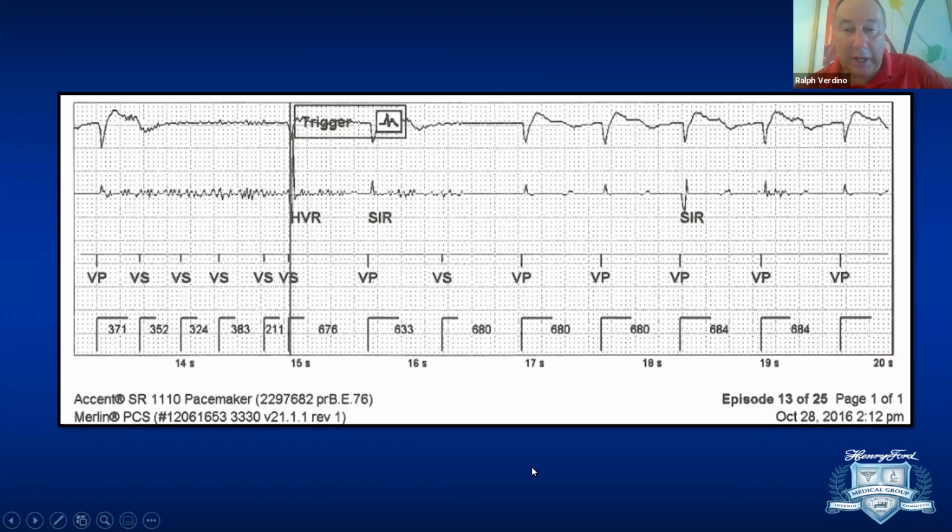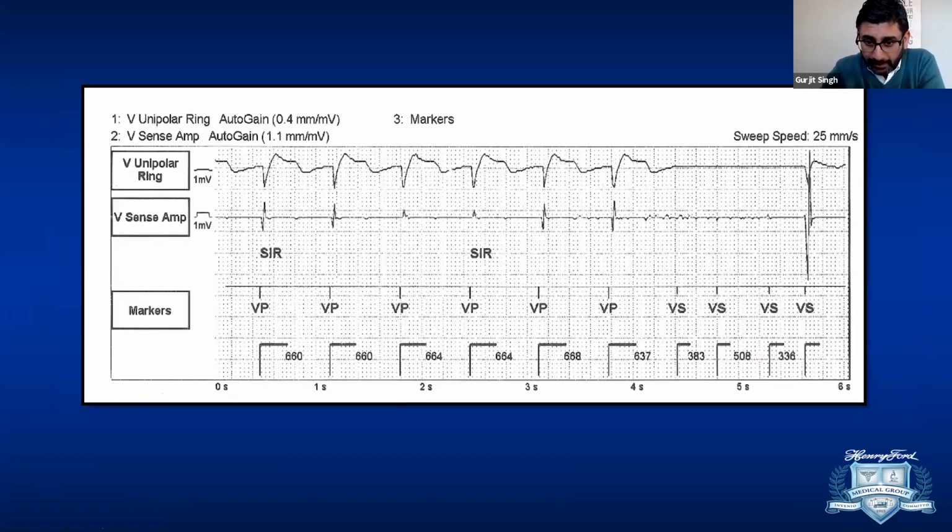We have noise, oversensing. Okay, very good. So yeah, that's correct. It's noise which was being oversensed as a non-physiological signal. Remember, this patient has had AV node ablation done. So whatever is happening here, the pacemaker thinks there is QRS activity and it stopped pacing. So this patient is actually passing out or becoming dizzy and lightheaded, being pacemaker dependent. And this patient kept doing this multiple times.